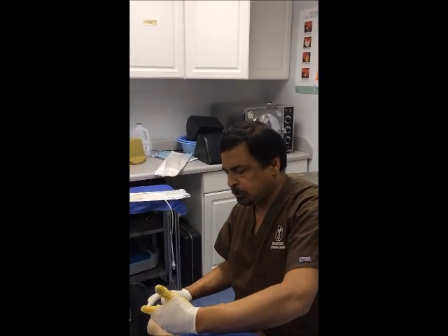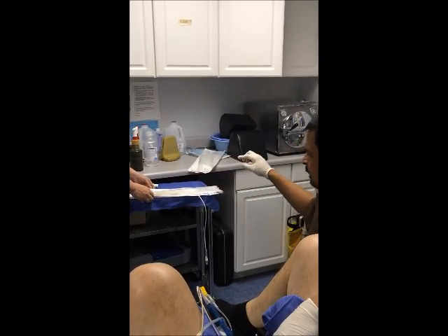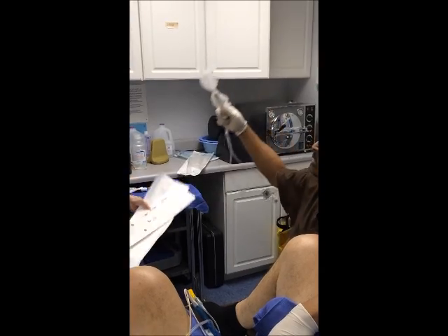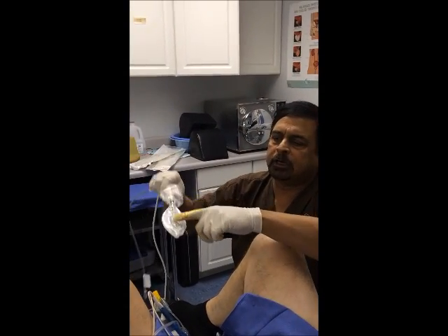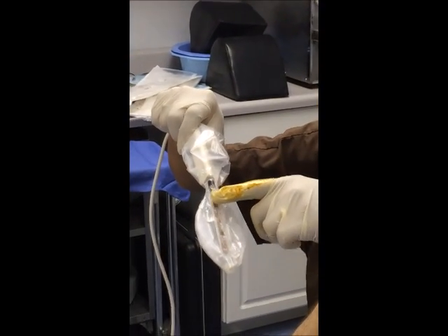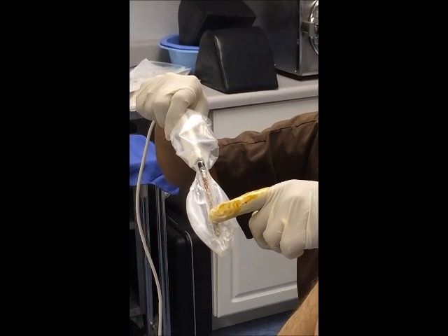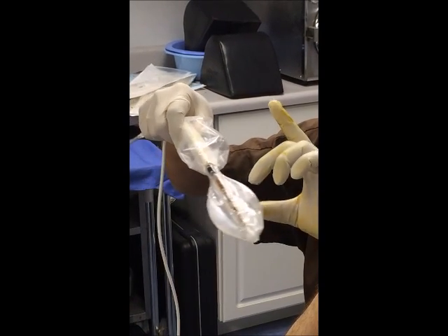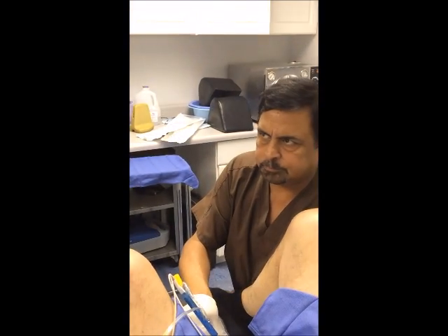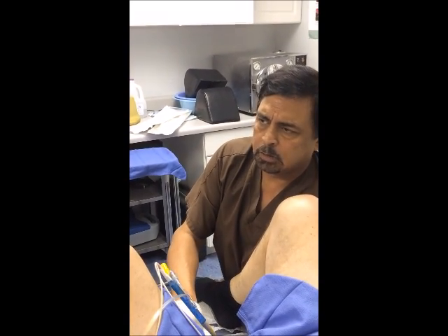I ask the patient to bend both knees and I put the rectal probe in. The rectal probe is prepared with a balloon and temperature sensors. It has five different spots for monitoring temperature, so it's very accurate — even if one spot gets covered by fecal matter, the other spots can pick it up. The balloon is inflated to keep the temperature sensors against the anterior rectal wall.